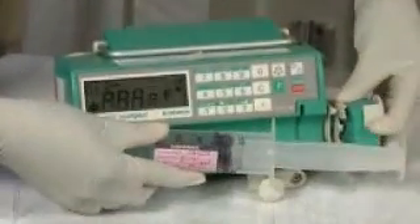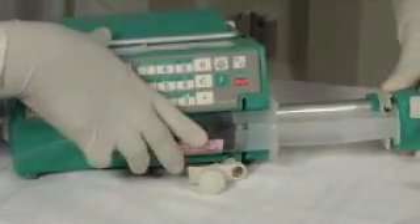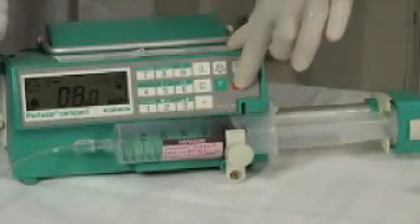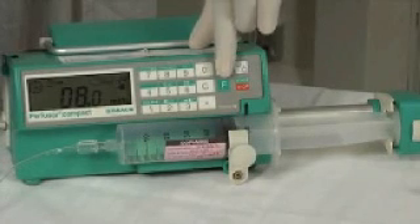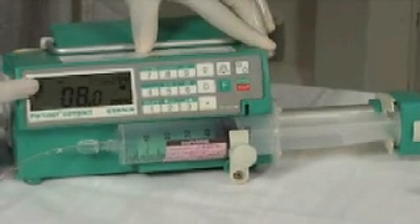Then place the new syringe into the pump and secure it using both the locks. After that, press the start button and turn off the alarm. The rotating wheel shows the flow has started.